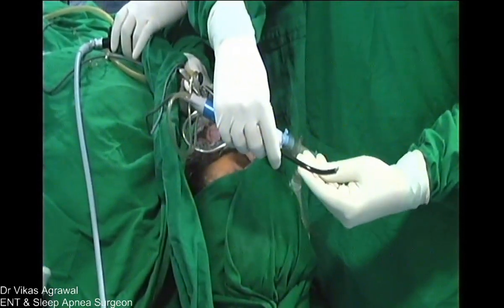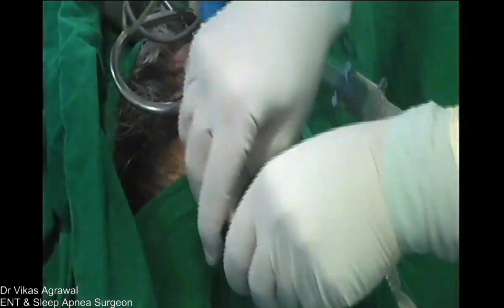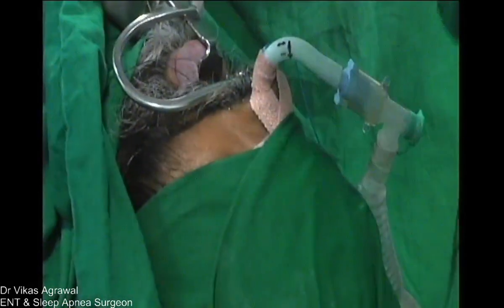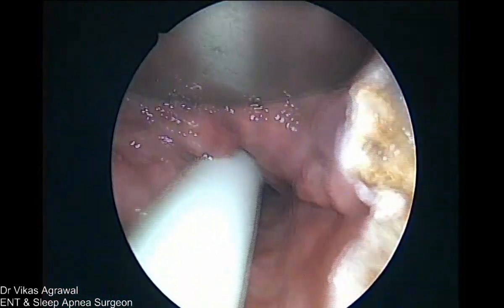Is it very well seen? Is the bend seen well? So now this wand will be able to reach the depth of the vallecula. Then I am sitting on the patient's side. Patient is always in head low position.